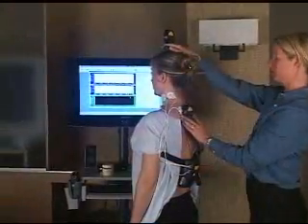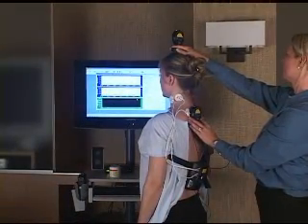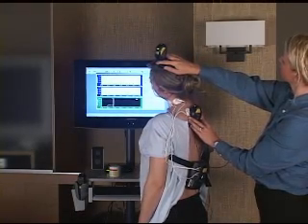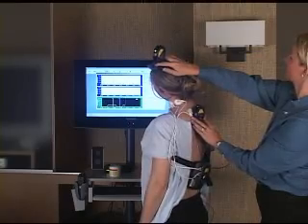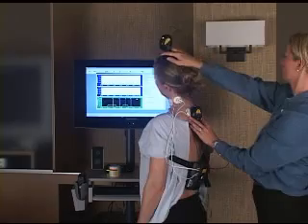So now we begin the next test, which is lateral flexion. You can place the probes so that the FlexVisions are this way, or you can flip them upside down. Here we go, lateral flexion. Go to the left, mark it at the peak, back to neutral, mark it at the valley. Go to the left, mark it at the peak, back to the center, mark it at the valley.